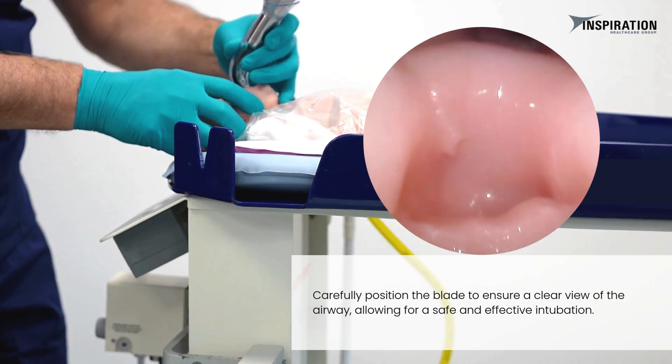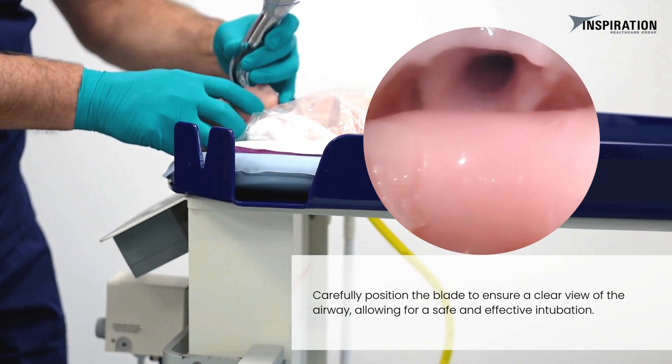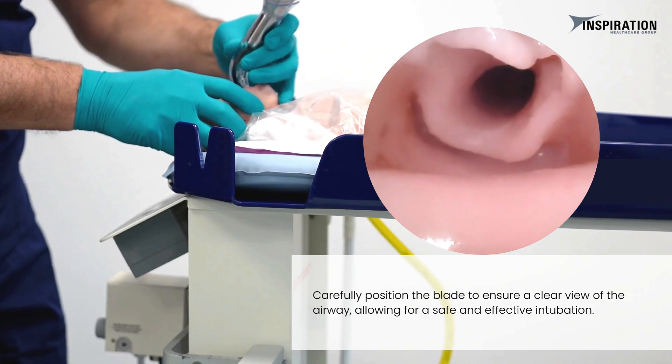Carefully position the blade to ensure a clear view of the airway, allowing for a safe and effective intubation.